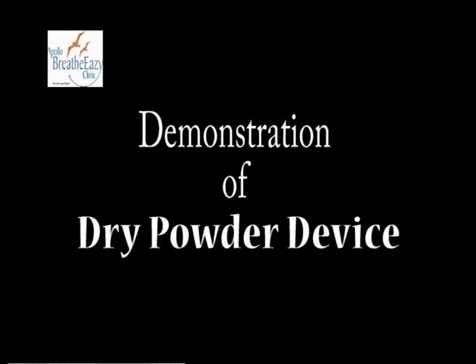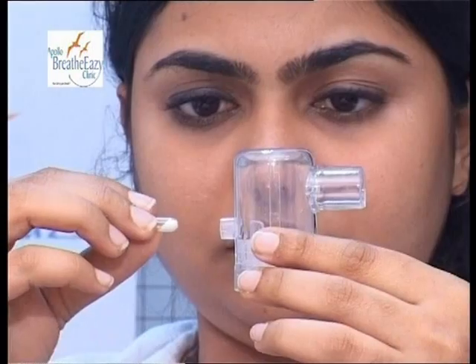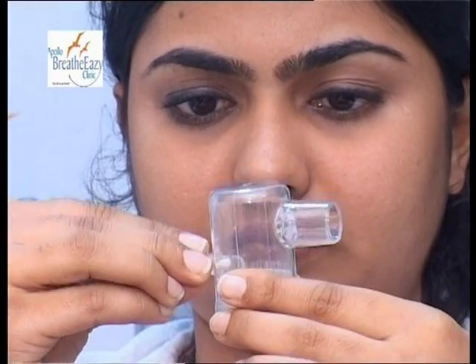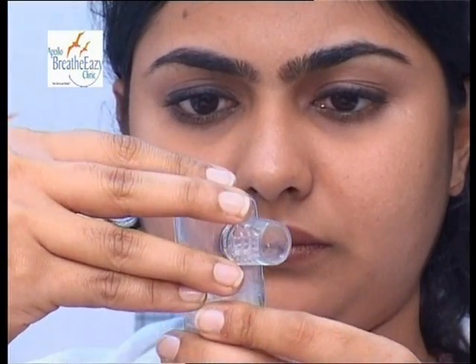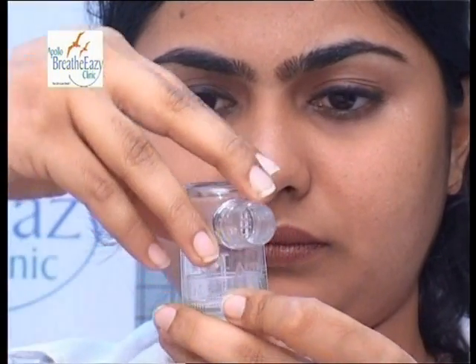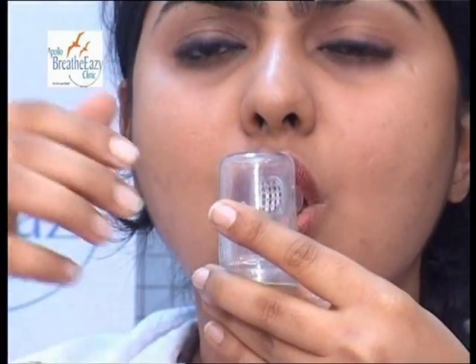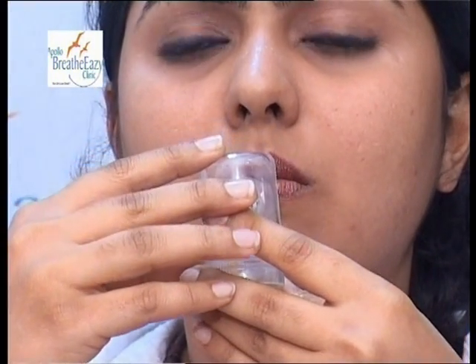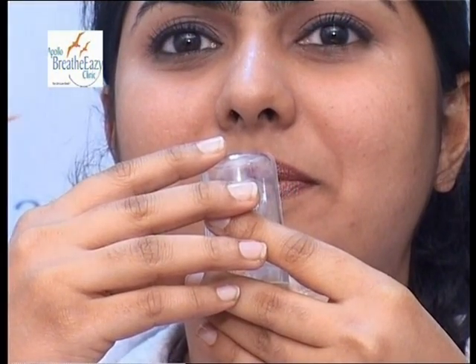This is a dry powder device. Take the dry powder capsule and load it with the transparent side facing inwards. Twist the device to break open the capsule. Then deeply inhale through the mouthpiece, hold your breath for 10 seconds, and exhale.